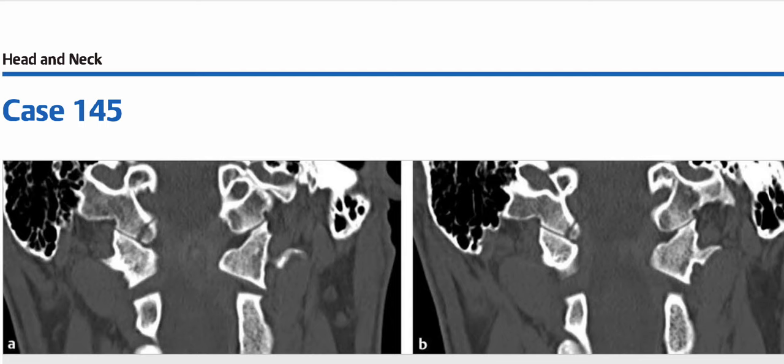These are images of a 28-year-old man involved in a motor vehicle accident. The coronal reformatted CT images show a vertically oriented lucency or medial avulsion fracture of the occipital condyle on the right with minimal displacement of the fracture fragment. The key finding is a vertically oriented lucency through the occipital condyle and the diagnosis is occipital condyle fracture.